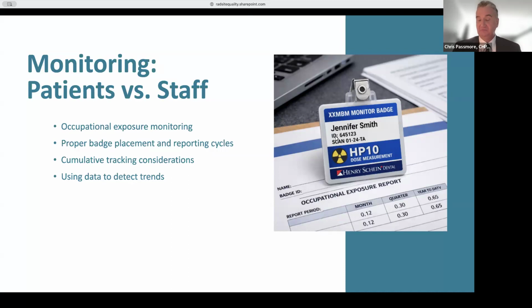The important thing at that point is to check the dose reports to see how many folks are showing higher doses than before, who may be getting a lot more dose than anyone else in the area, because their technique might be different than someone else's, and they need to correct their procedure. Look to see how many people exceed 100 millirem and how many exceed 500 millirem. It's very important to keep an eye on your workforce to verify how they're performing. And then I would even look at how many measurable doses you're seeing as compared to last year.